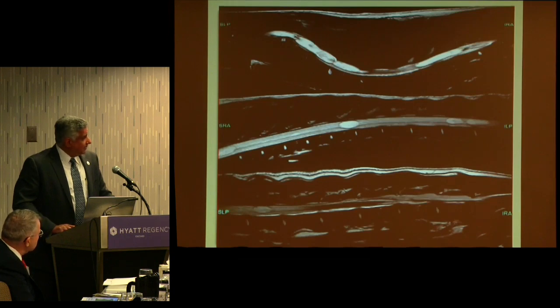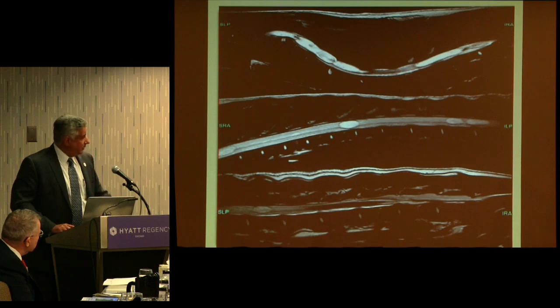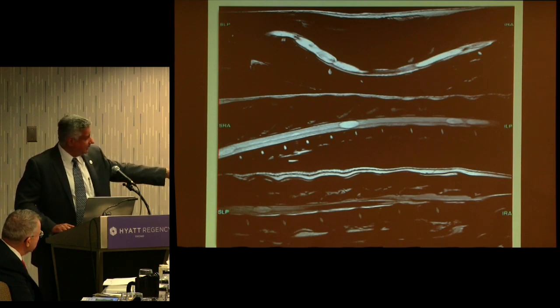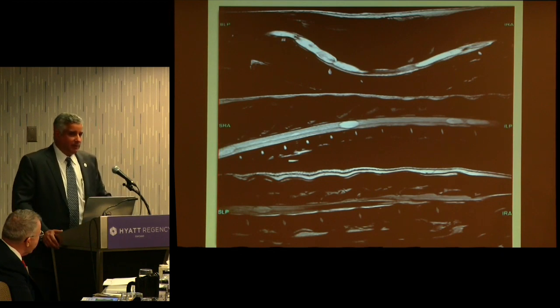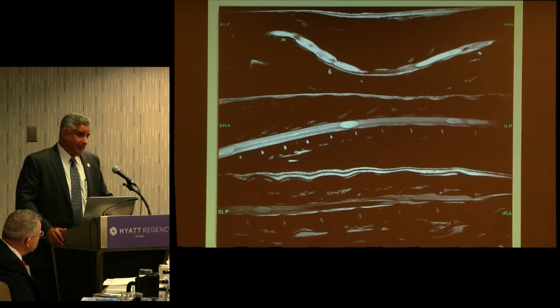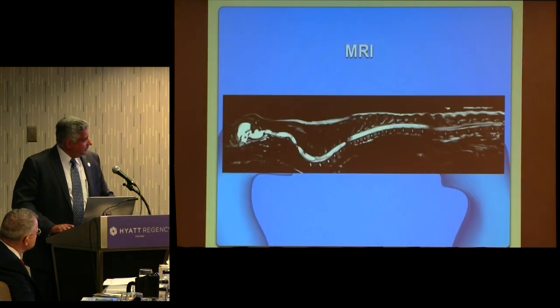Just quickly, I segmented out some of the MRIs. Up there is the cervical region. You can see the syringomyelia is quite profound, traveling all the way down to the thoracic region, pocketing periodically down to the lumbar region. It's hard to discuss reversible changes in a patient like this, even though it was fairly acute when you think about it. The dog's 6 months of age. So within a matter of months, this seemingly developed. Great owners, enthusiastic, and a lot of feedback from you all on what to do. So we run a 3-Tesla MRI. We're able to get mobi views. So this is a nice way to sew the images together to get a perspective of what you're dealing with.